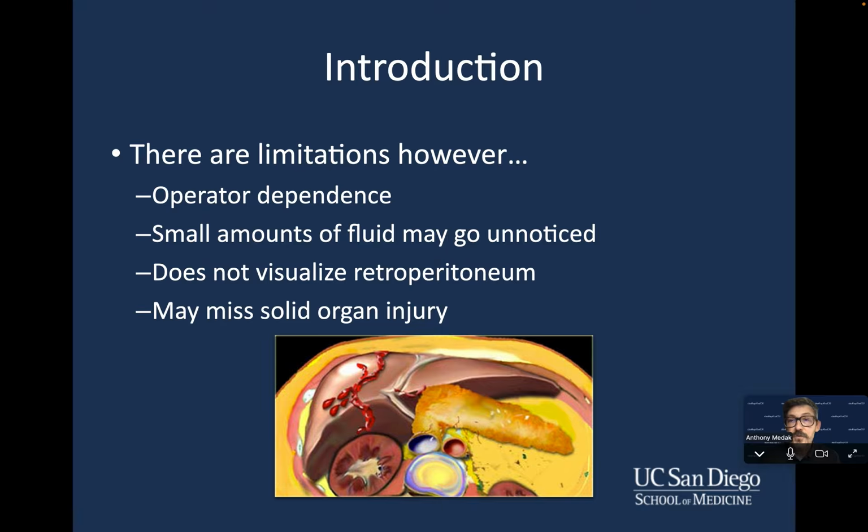And then the first bullet point on this slide is personally something that kind of irritates me, to be totally honest, because oftentimes people that are not familiar with the technique will talk about the downside of ultrasound being, quote, operator dependent. In other words, if you are a novice, you're not as good as if you are experienced. And while that's certainly true, I think most things in life, including being a good medical student or being a good clinician, are operator dependent. So for me, that one isn't really a big factor, but the other 3 points are indeed important.